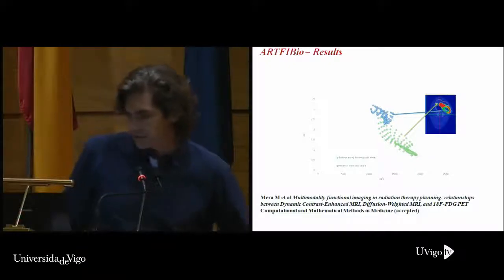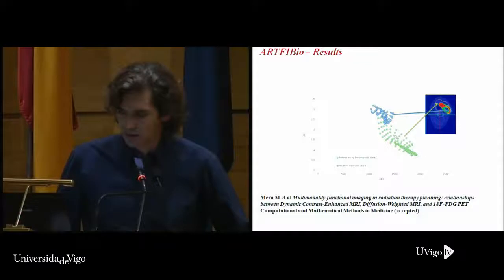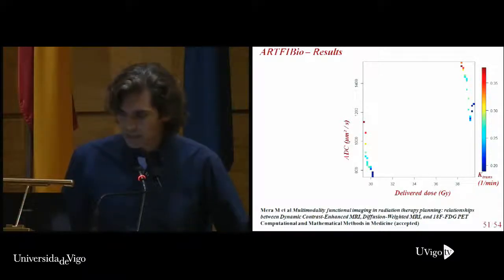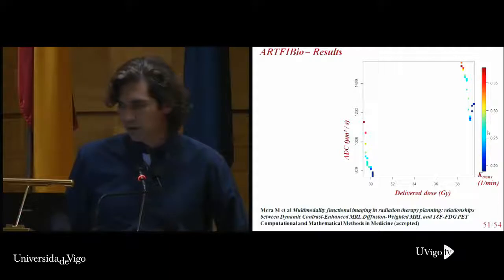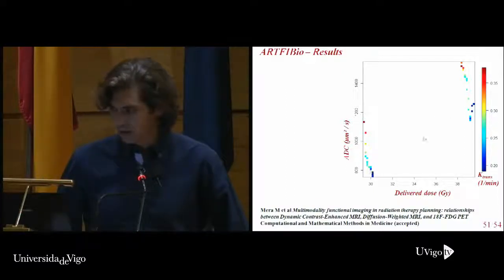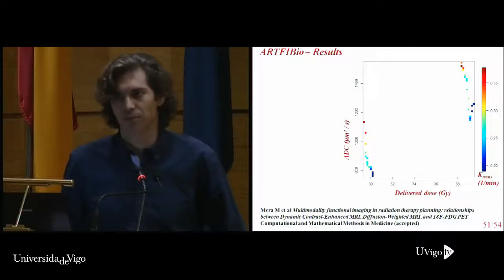Here we have a comparison between ADC and the standard uptake value, and we can see again that in the well vascularized area there is a variation of data corresponding to different oxygenation conditions, and in the hypoxic region they get the maximum values. Also, if we study the ADC along the treatment, this is the delivered dose, and this is the ADC, and we would like to see how K-trans, like the hypoxia, modulated the response of the tumor. The less vascularized area has worse response, or less increment in ADC, and the well vascularized area has a higher increment in ADC and probably a better response.